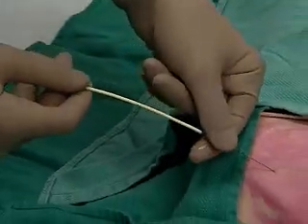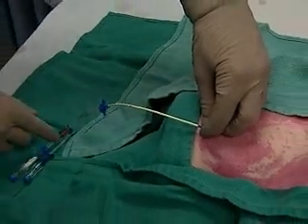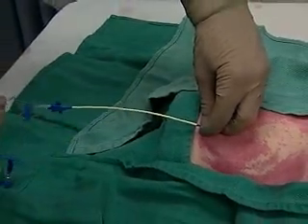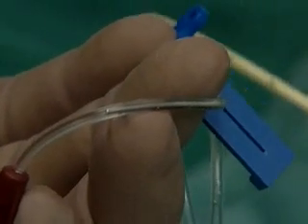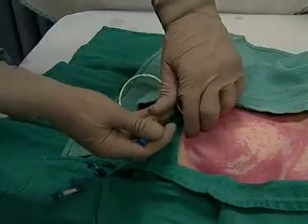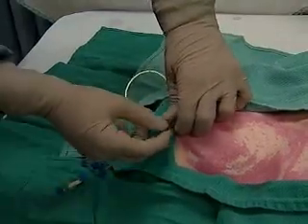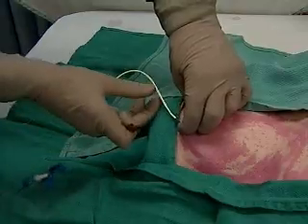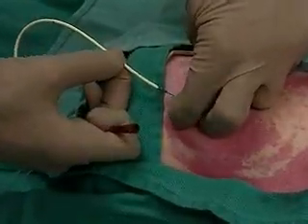Now we advance the central line catheter over the wire, partly withdrawing the wire if necessary, until the wire is seen at the catheter hub. Uncapping that hub, we'll advance the wire backwards until it exits the port.